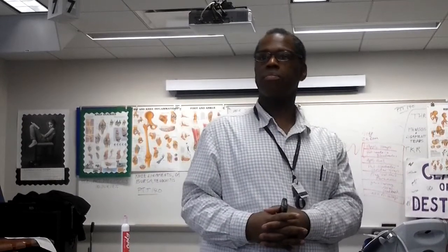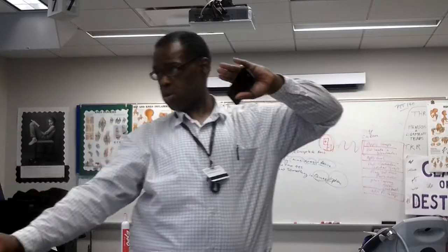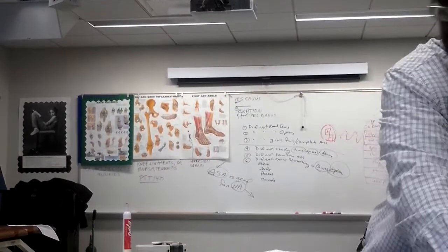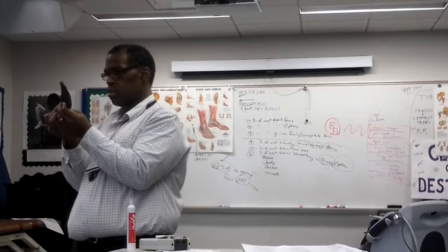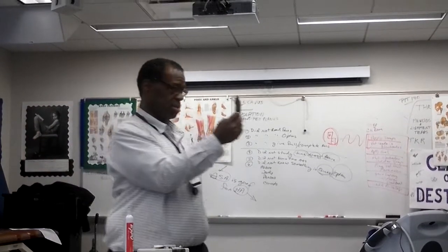Okay, good. All right, so now we're getting deep into detail. What makes it monopolar? One dispersive, one active, and you're going to feel it out of the active or the smaller pad. Okay. What makes it bipolar? Two active pads. Do you see what it says there? It says close size. Is this bipolar? Yes. Why is it bipolar? Because it's not twice the size, but it's not the exact same size either.